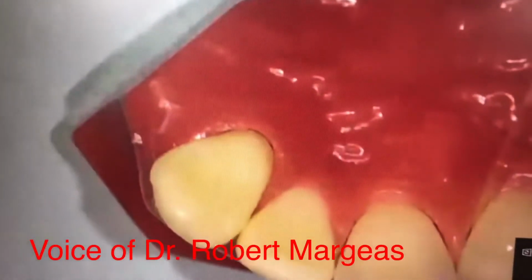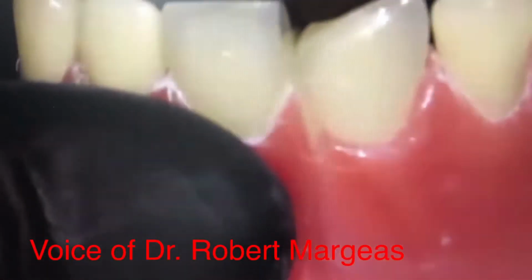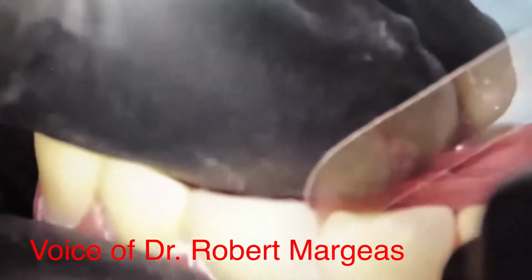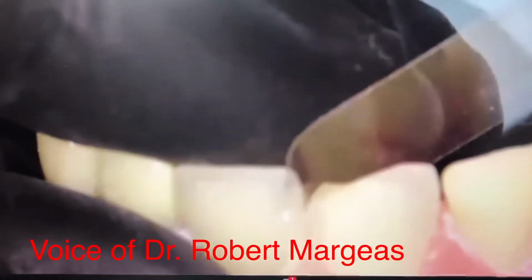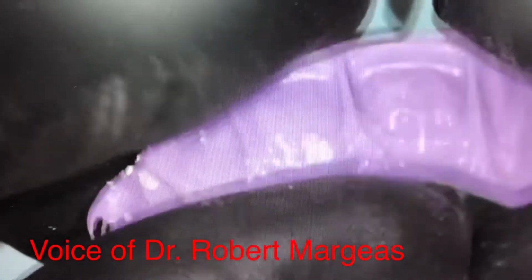What you want to do, whether you're using All Bond Universal, MPA, or Scotchbond Universal, is make sure you scrub that for 15 to 20 seconds, and then air thin it and evaporate that solvent. You want to get rid of the solvent, and I want to do that until there's no fluid movement of that. Then I can take my strip out. Now, where I place that line is where I want to place my material.